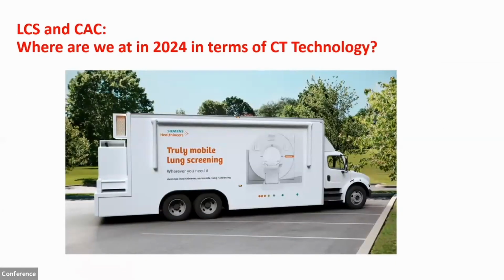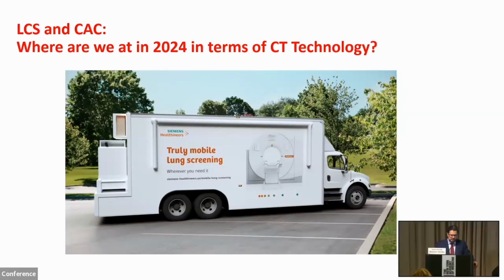There is also a growing trend in being able to bring this technology to a mobile solution. These systems are not only capable of doing lung cancer screening, that's definitely a number one motivation, but the systems are also capable of doing coronary artery calcium.